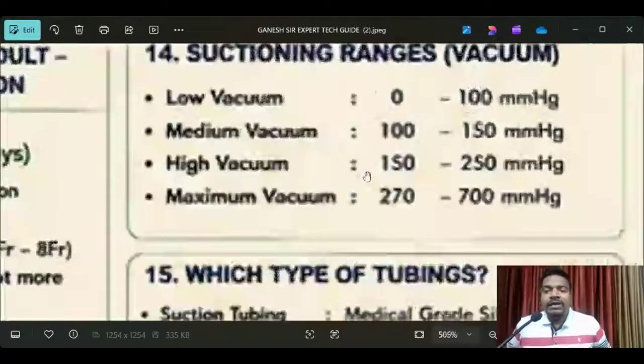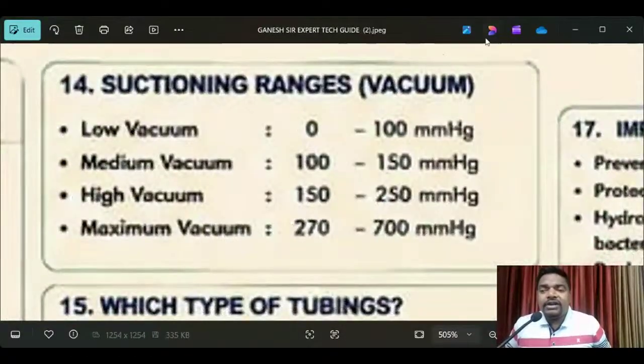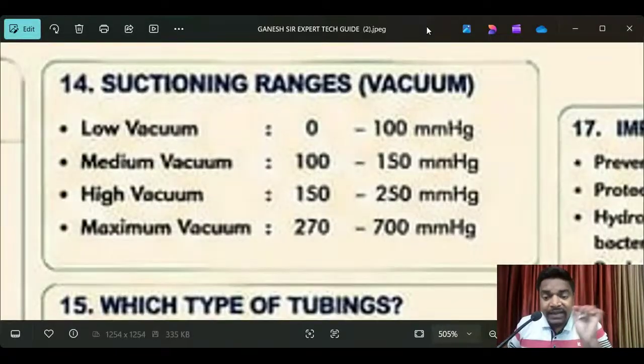Now, see here again, in these live sessions I'm covering only biomedical engineering service purposes. For whoever is working as a biomedical engineer, to do your work and repair, what are the things you need to follow? As a biomedical engineer, first of all you have to repair. Don't immediately recommend replacing the parts or buying new things. We have to provide the services using your technical skills, because skills are very, very important in biomedical engineering.